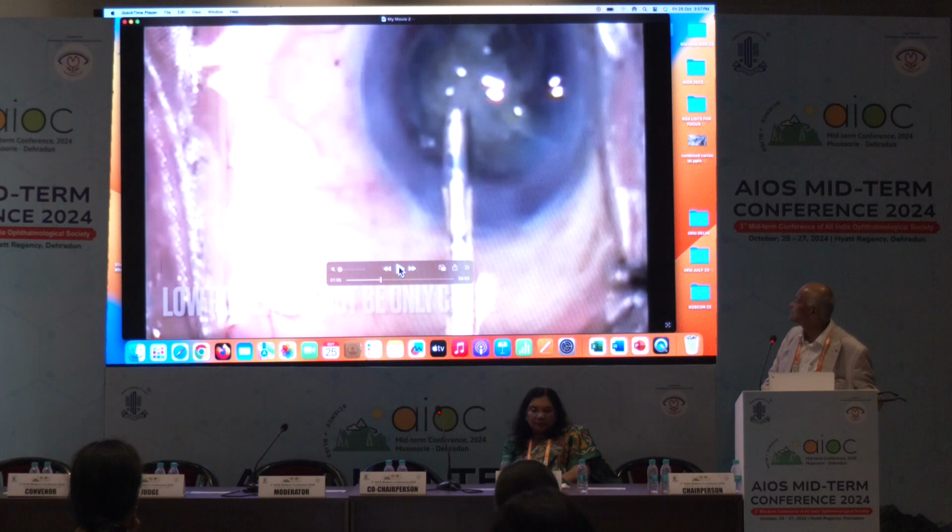Now here you will see, this is me, it is not some other person. I am doing the phacoemulsification. What is happening? My phaco tip is moving.